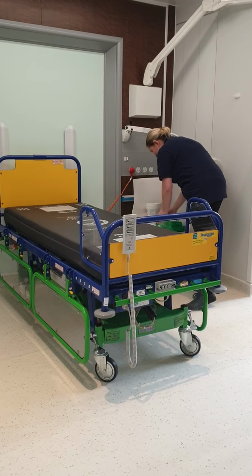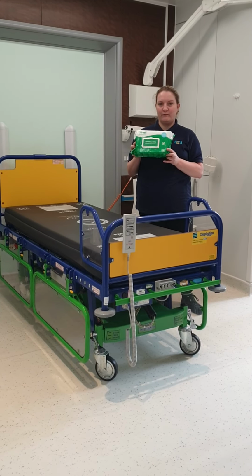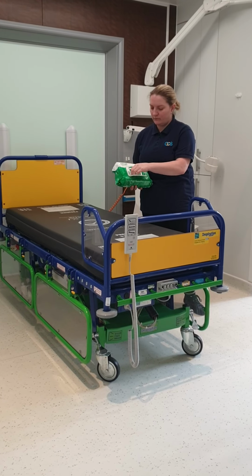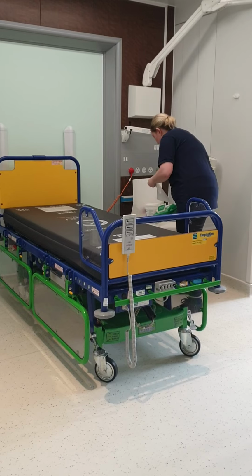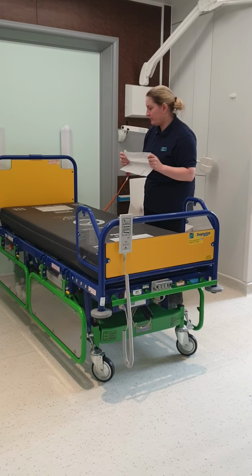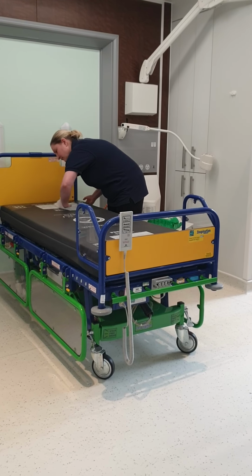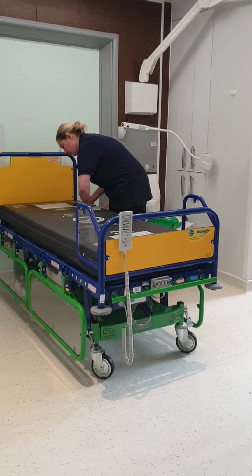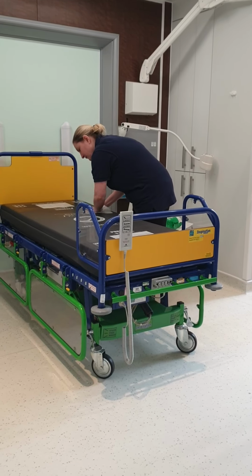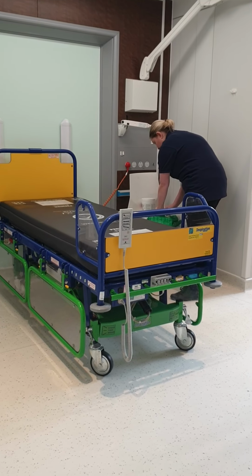Once you've selected your wipe, the first step, as with all of our principles, is to take a single wipe out of the packet and open it flat so the entire surface is available for cleaning. This is crucial to ensure that the cleaning agent is equally spread across the surface. When you start cleaning, you will use a single wipe for about 1 meter of a surface and then dispose of it.